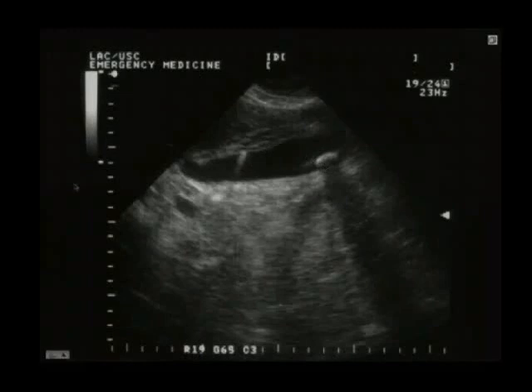It's about, more than a centimeter thick. Okay, this is a very inflamed gallbladder wall. This is actually a patient with cholecystitis. So when you have a really edematous, inflamed gallbladder, the wall will thicken.